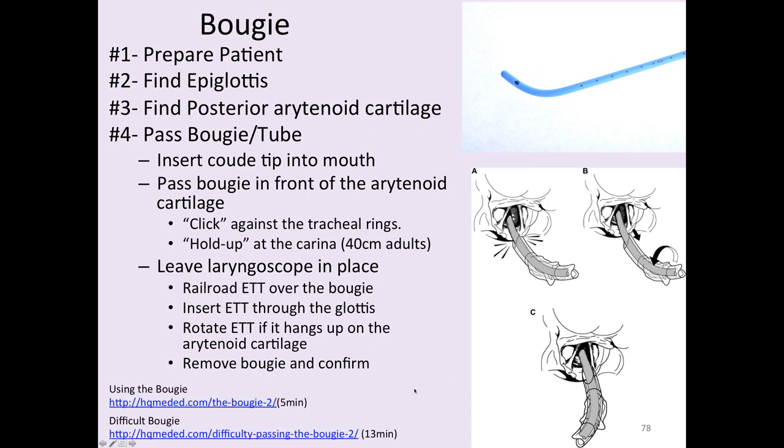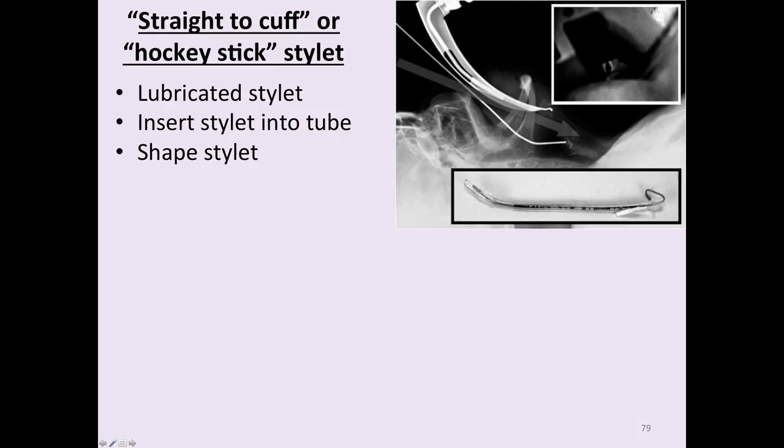Again, there are 2 fantastic videos on some awesome tricks on how to use the bougie. Also, they give you a great feeling of the anatomy down there that most of us don't get to see. And I highly recommend these 2 videos as well.